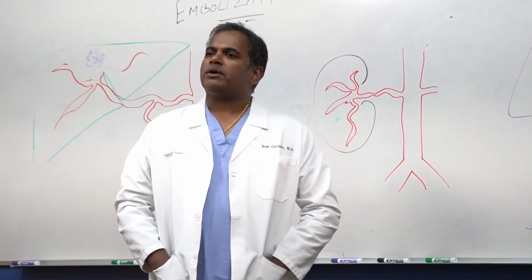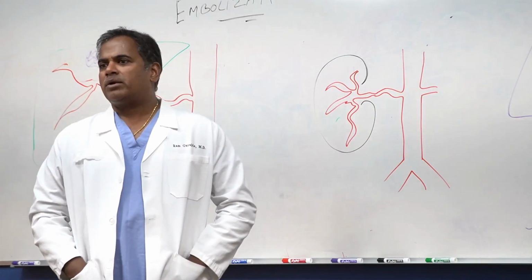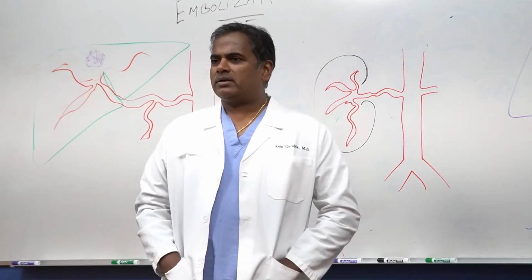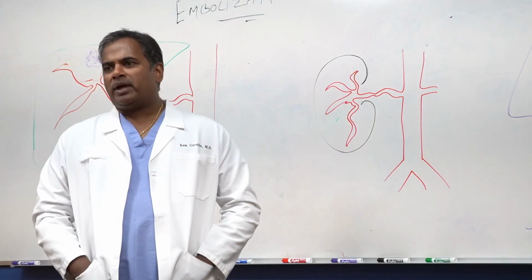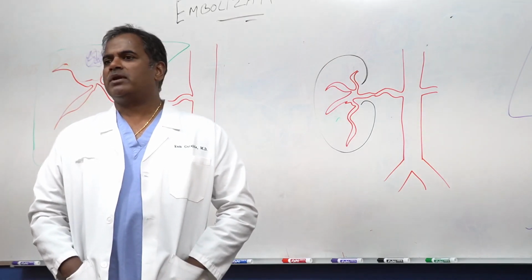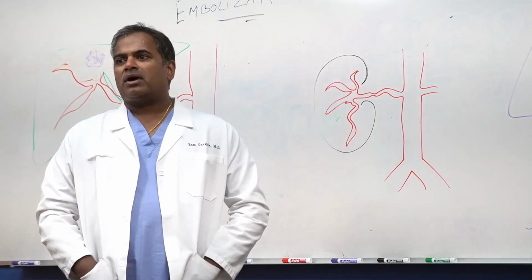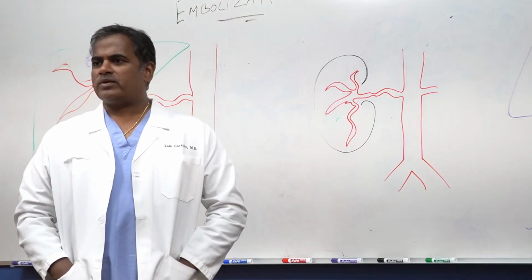How is this performed? Tumor embolization, or any other embolization, is performed using imaging such as ultrasound or fluoroscopy. Fluoroscopy is an X-ray video. A small incision is made either in the groin or in the arm area to access the blood vessel. Through this blood vessel, a catheter is carefully threaded into the vessel. Contrast dye is injected through the catheter to visualize the blood vessel.